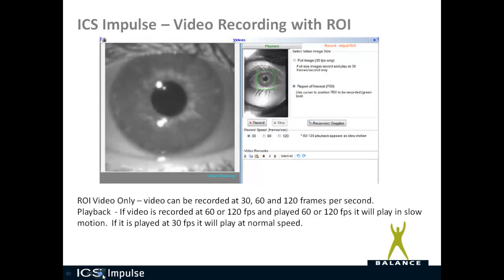Your other option is region of interest. So you can choose just the area of the eye that you want to record instead of the full image. For region of interest, you can record the video at 30, 60, or 120 frames per second. And if the video is recorded at 60 or 120 frames per second and played back at 60 or 120 frames per second, it'll be in slow motion. If the video is played back at 30 frames per second, it'll play at normal speed.